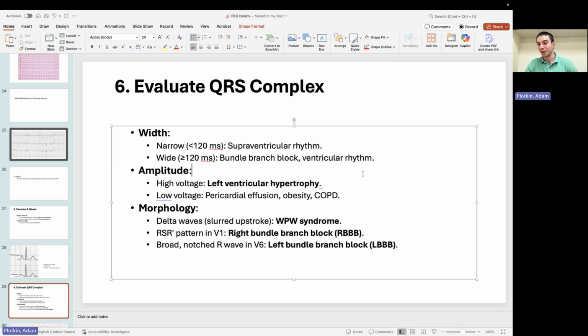Whereas if this was a normal healthy patient, we go down both bundle branches at the same time, depolarize the ventricle at the same time, and then repolarize. You get a nice, quick, small QRS, less than 3 little boxes. But when one of the bundle branches is blocked, the other side is perfectly fine, but all that electrical activity has to move all the way across the heart. And that's going to be slow. That's going to be a nice wide QRS. And you can often see those RSR prime patterns.